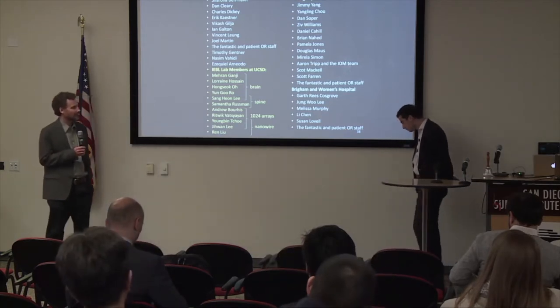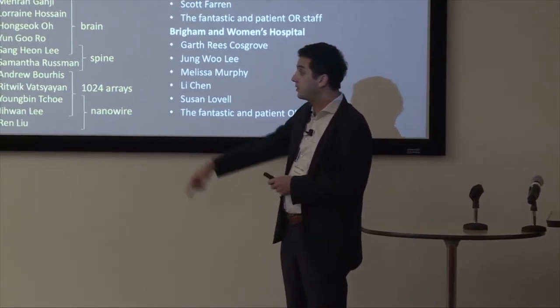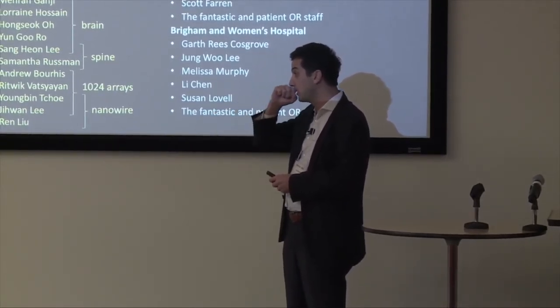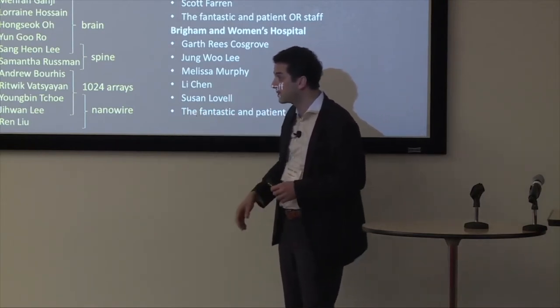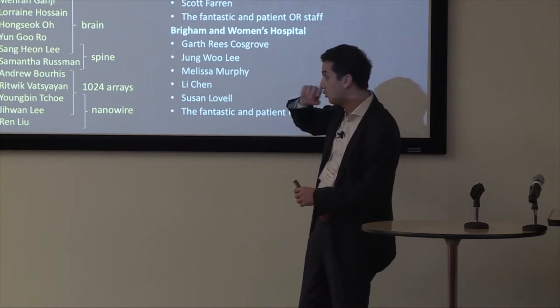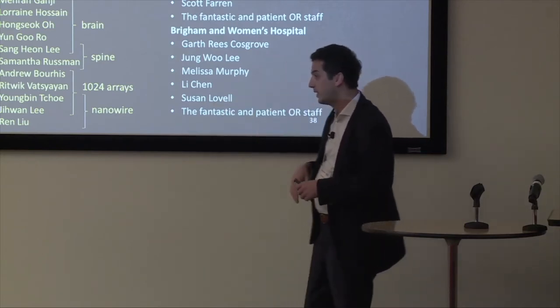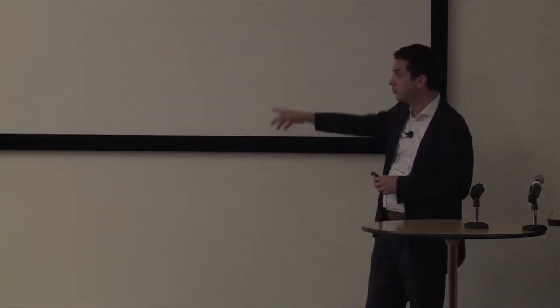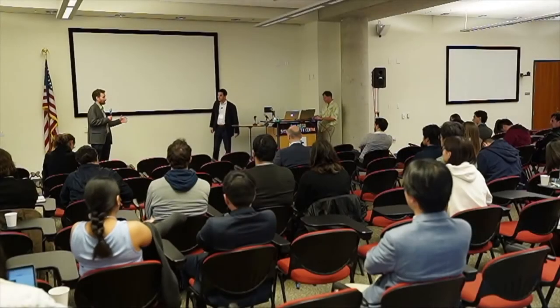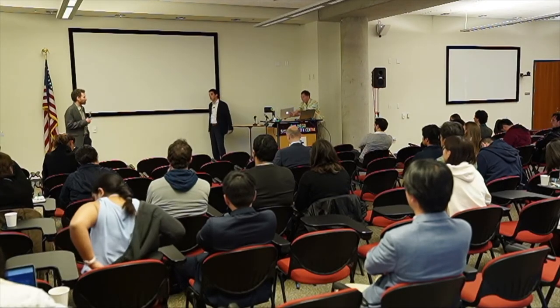Yeah, so usually the impedance at micro scale is dictated by the circumference, where edge effects are usually maximal. And as we go to larger contacts, these edge effects have lower influence. So we see the maximum benefits in platinum nanorods at smaller contacts, where this edge effect is really large, and it decays as we go to larger contacts. The reason is mainly current crowding at the edge of the contact that contributes to a series resistance which scales with circumference. And this effect fades away as we go to larger contacts. So that suggests you may be better off having islands of electrodes rather than solid electrodes, right? Yes, we're exploring that for larger current carrying electrodes.